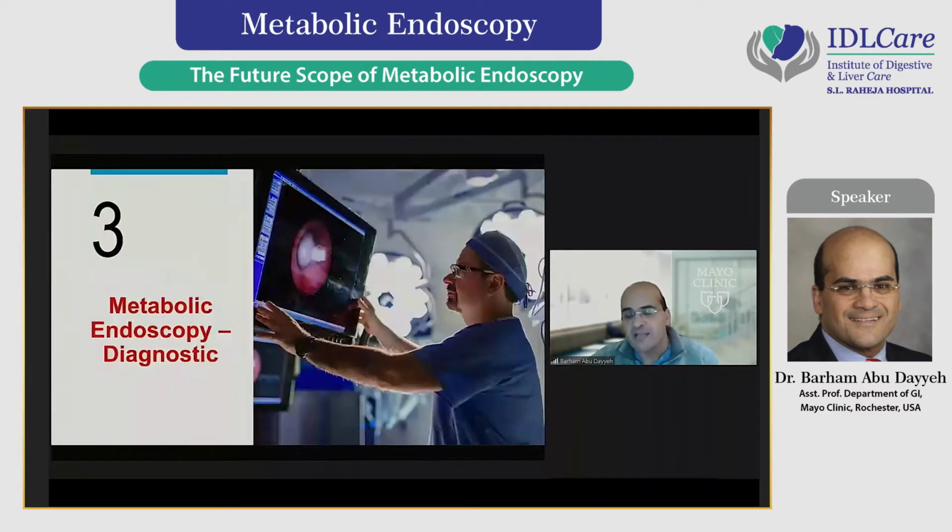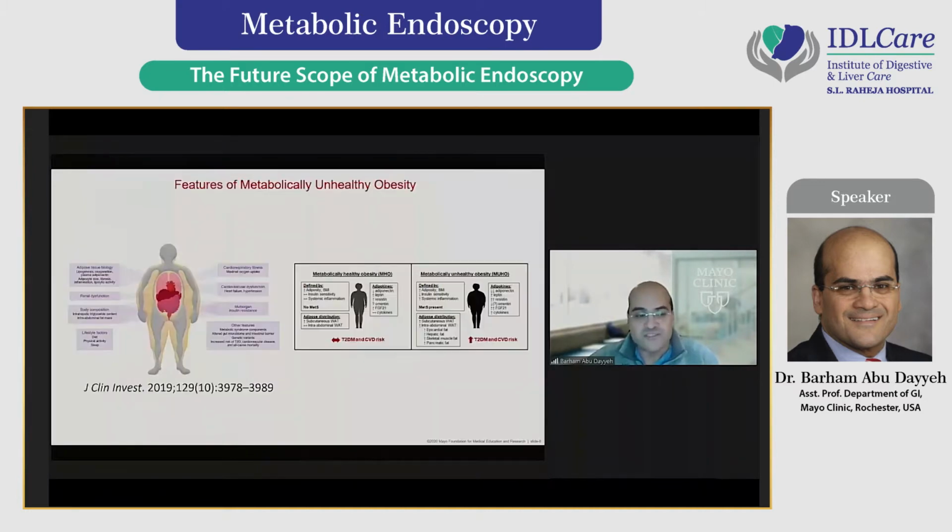So when we talk about advances in metabolic endoscopy, I'm going to break them down into metabolic endoscopy diagnostics and therapeutics. There's a lot we know about how we could use endoscopy to diagnose metabolically healthy versus unhealthy obese, because they're not equal. They both could share the same body mass index. They could both share the depot of subcutaneous fat, but visceral fat is a different story.